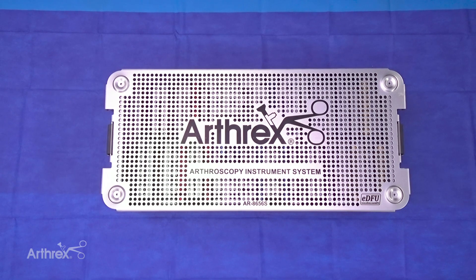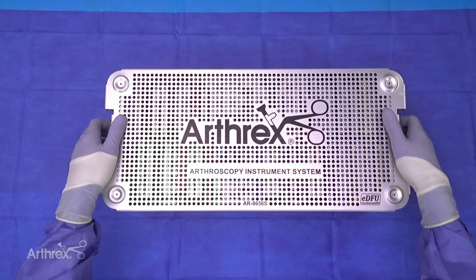Hi everybody, my name is Zach Day, one of the product managers for the distal extremities team. Today I'm going to do a quick overview of the new Arthrex Arthroscopy instrument system — this is a very comprehensive set.